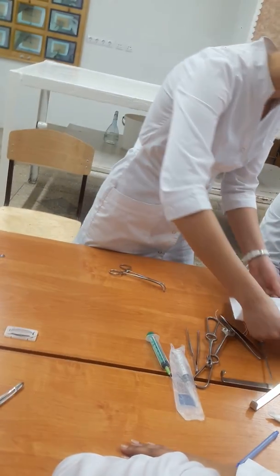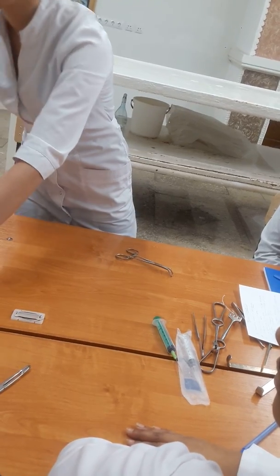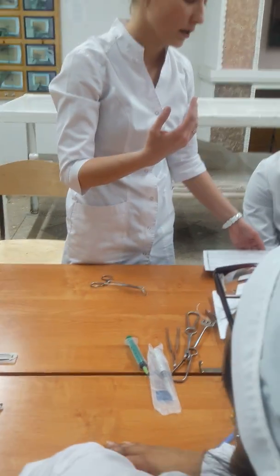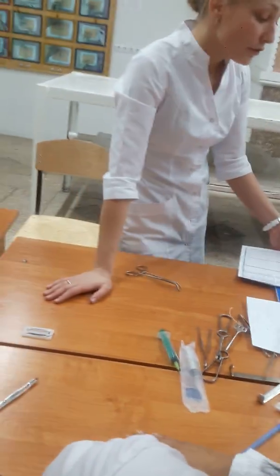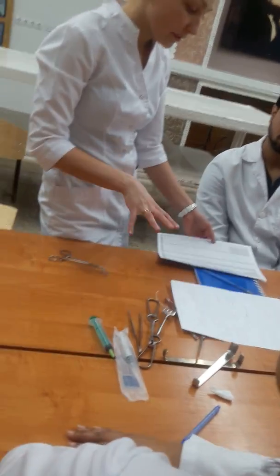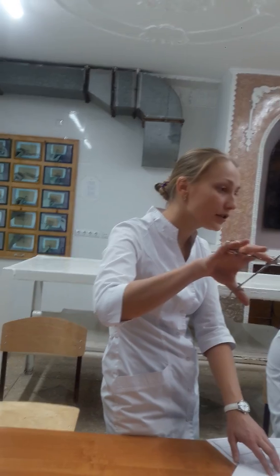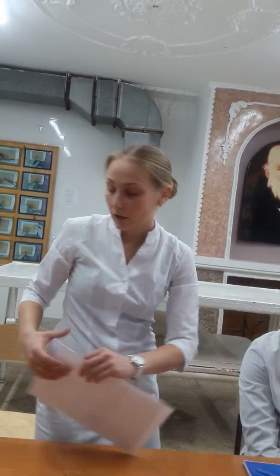You need to cover your wound with special towels, to protect all other parts of the skin from incisions on the one hand, and to protect my wound from microbes from other regions. To connect these towels, I use these towel forceps. This way. Okay.